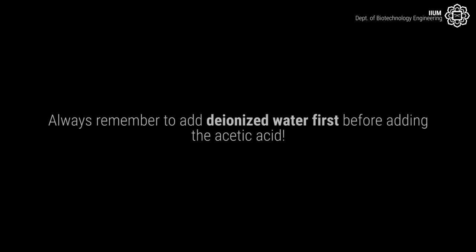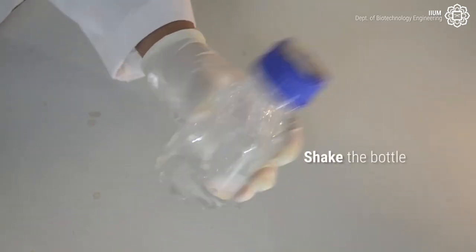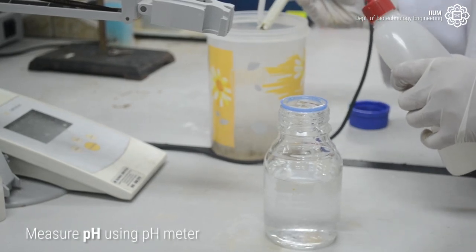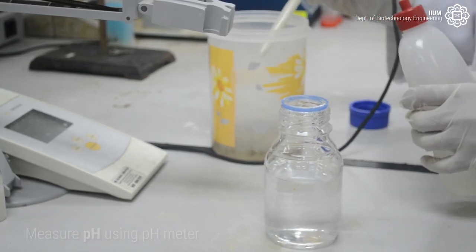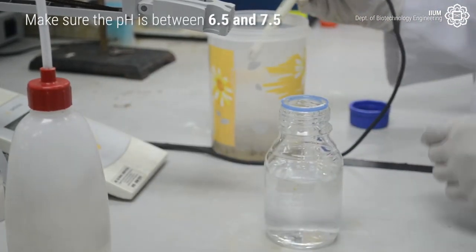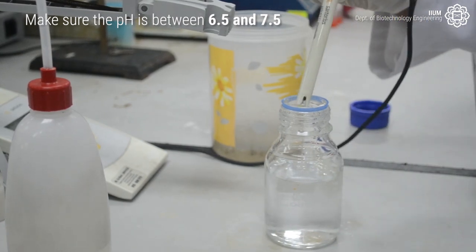Always remember to add the deionized water first before adding acetic acid. Shake the bottle. Measure the pH using the pH meter. Make sure the pH is between 6.5 and 7.5.